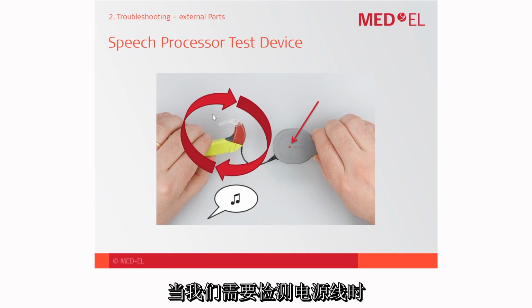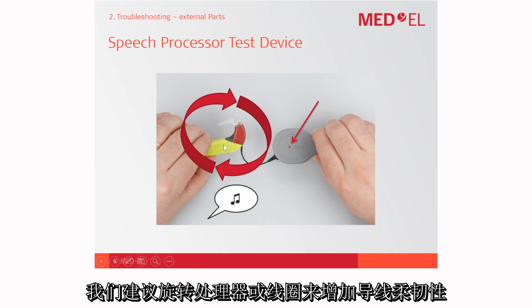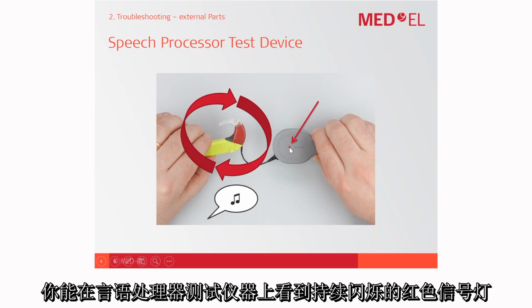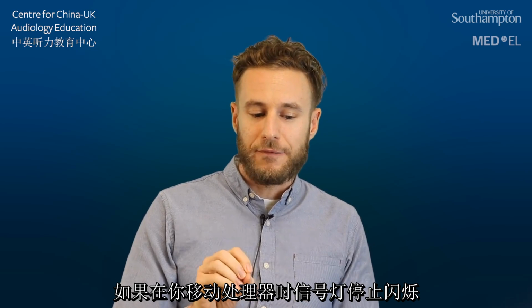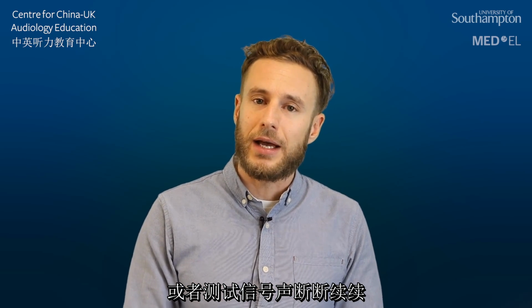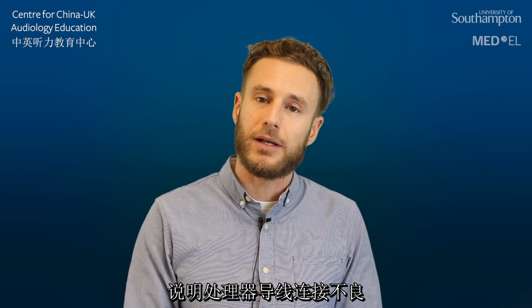When we assess the cable, then the speech processor test device is very helpful. So we always recommend to rotate the processor or the coil and therefore flex the processor cable and present a continuous, a constant tone. So you should see a constant flash of the red LED on the speech processor test device. If the light signal disappears while you move the processor and continuously present an acoustic signal, then this could indicate that the processor cable is faulty.